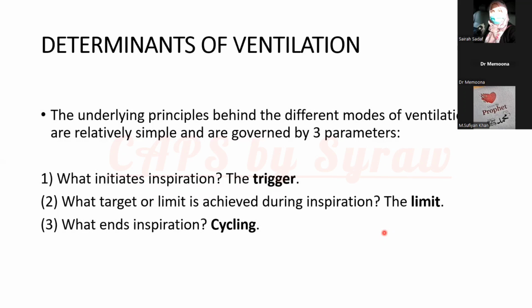The third concept is that the ventilator has to know for how long it has to give inspiration, and after that it has to stop and go into the expiratory phase. So invariably, the start of expiration is known as cycling.